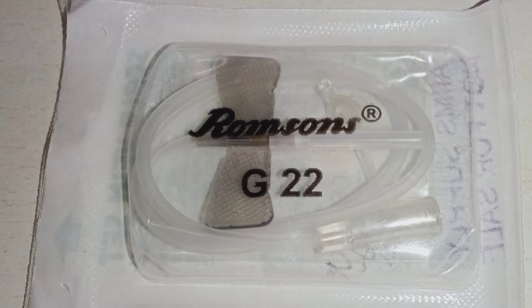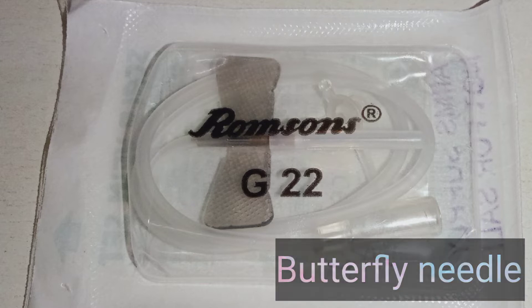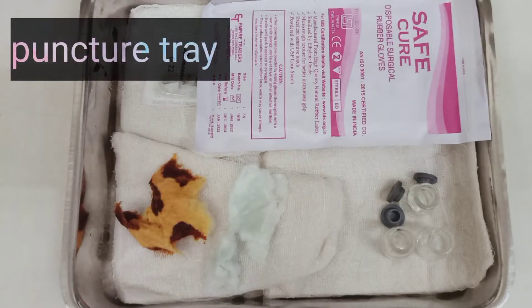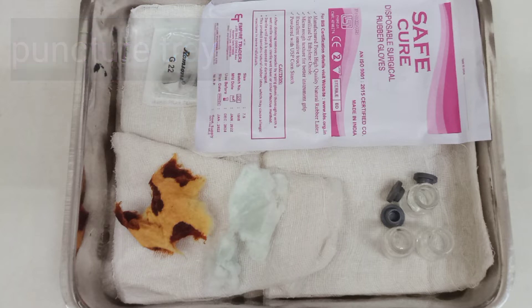A butterfly cannula is very frequently used to tap the Ommaya Reservoir. Here we use a 22 gauge butterfly cannula. Apart from this, the other equipment needed includes gloves, betadine, spirit, gauze, and CSF collecting vials.